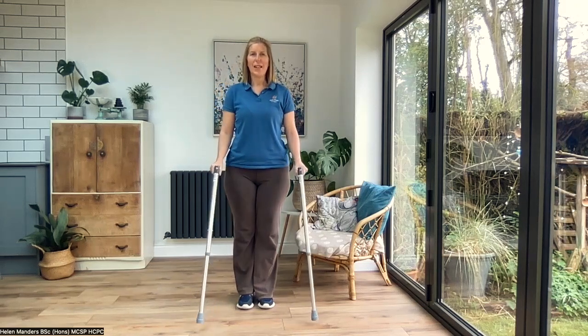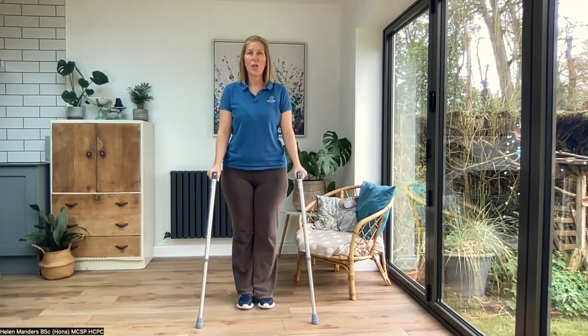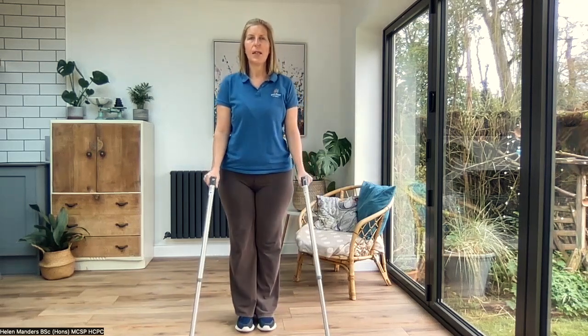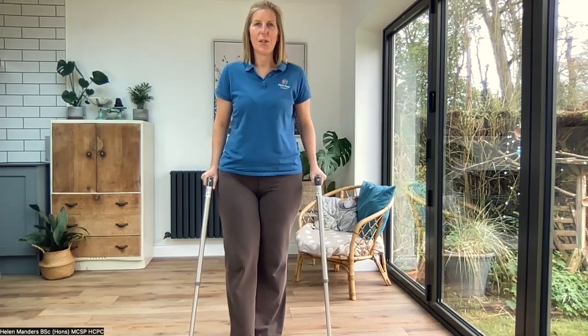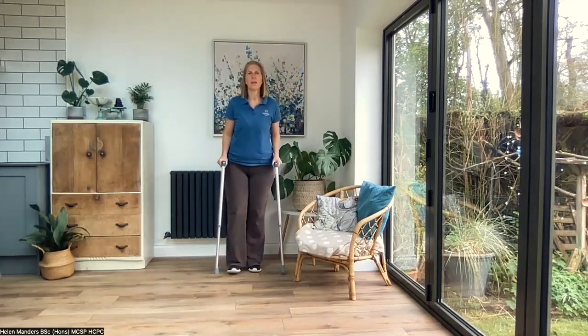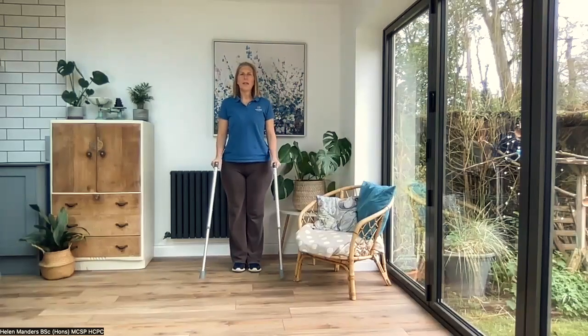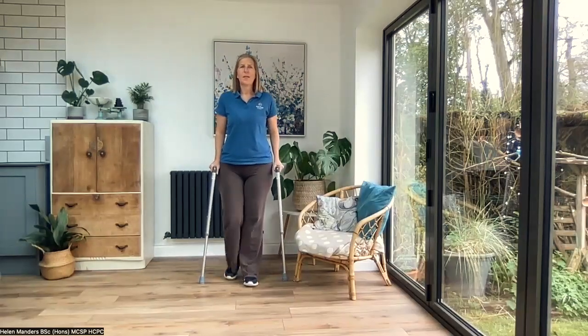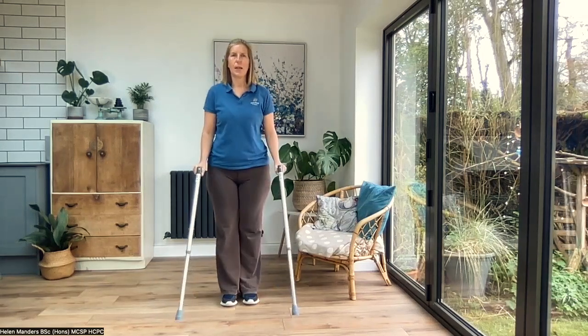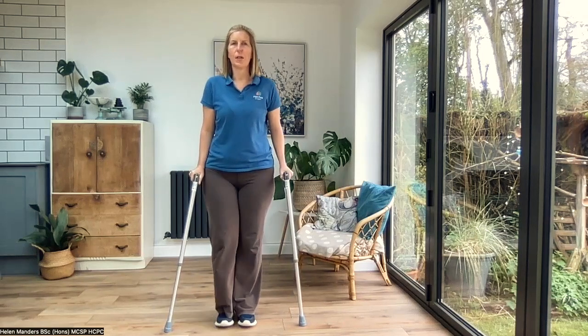Once you've moved your sticks, then you want to think about moving your bad leg first and then your good leg. So sticks, bad leg, good leg. This is the way that gives us the most support. Sticks, bad leg, good leg.